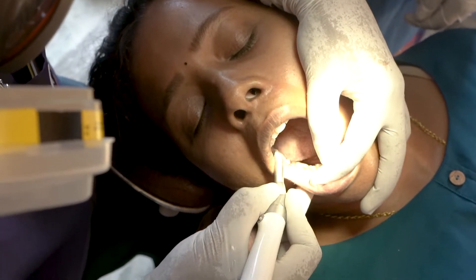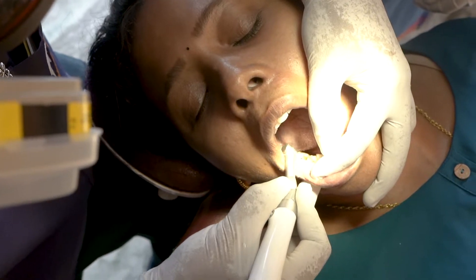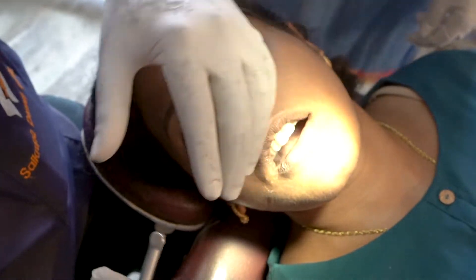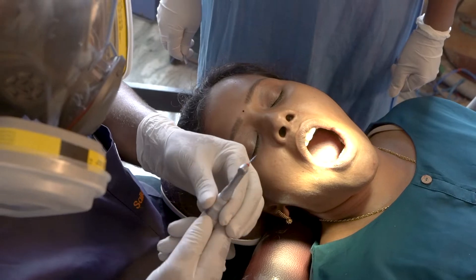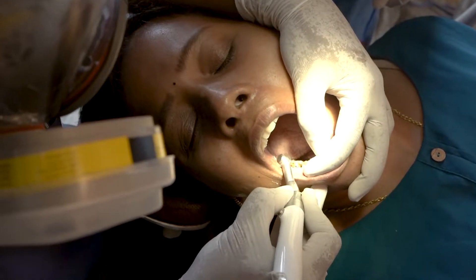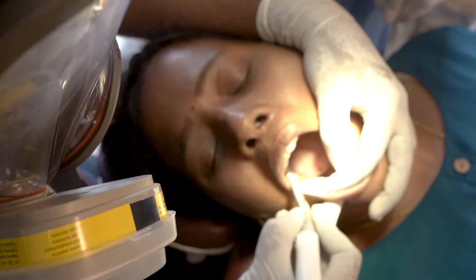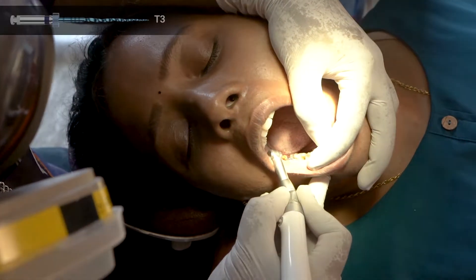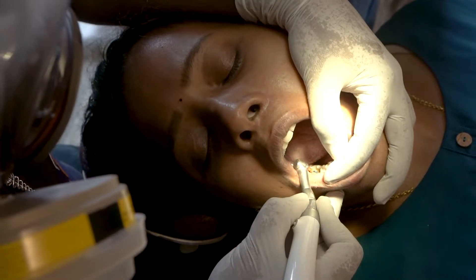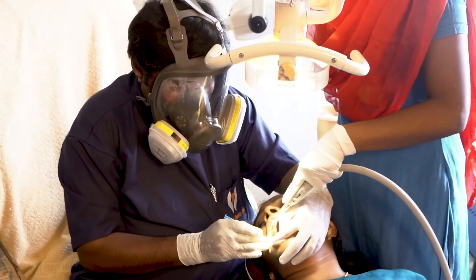This patient has got four canals. Two distal canals can be appreciated. Now the T2 file is engaged and biomechanical preparation is done. In this particular case, I have limited the mesial canals to T2 file, while the distal canals are engaged with the T3 files. This file system enables us to do a very quick root canal treatment with only three sets of files. Finally, the canals are irrigated.